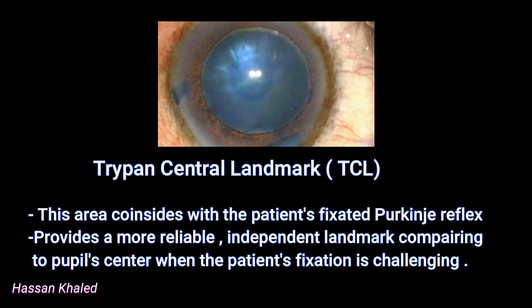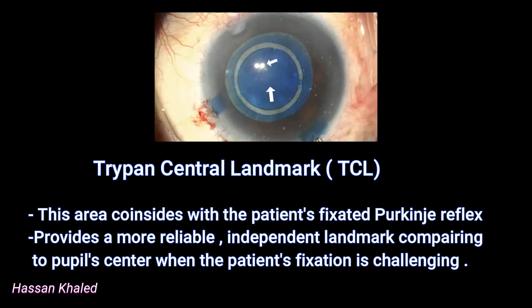As we can see here, it's very clear and coincides with the Purkinje image. But let's see another case.